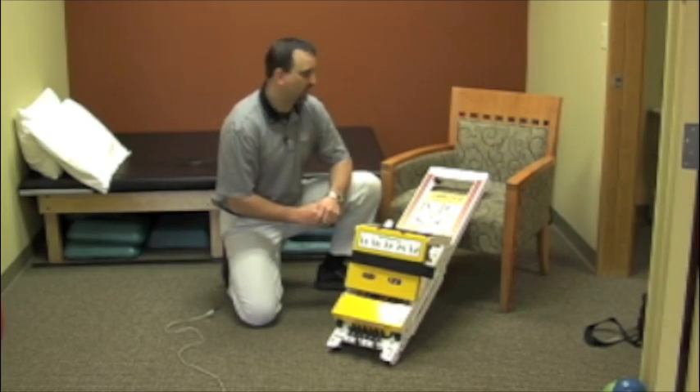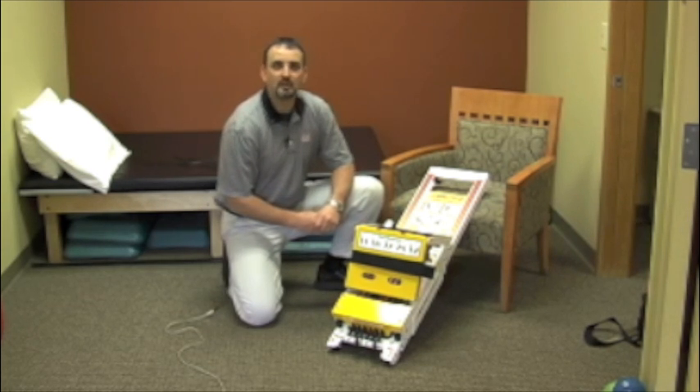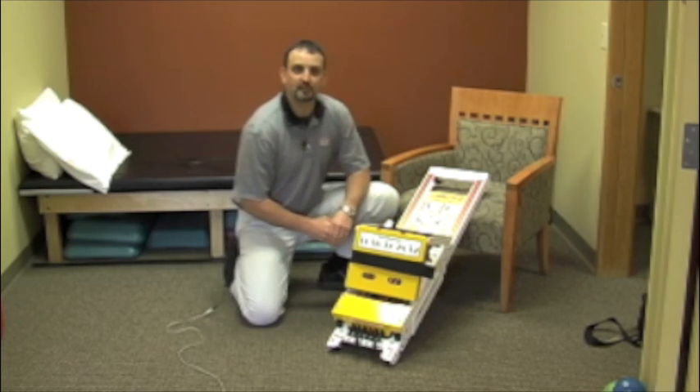Hi, my name is Bob Peoples. I'm here to introduce you to the Mini Press put out by Shuttle Systems. My first contact with this piece of equipment was about 10 years ago and I've been using it off and on since that time.